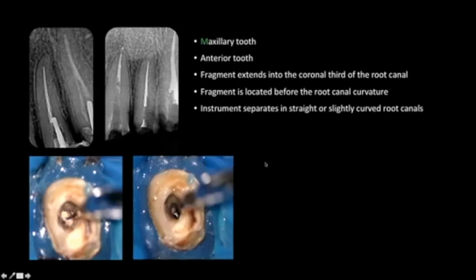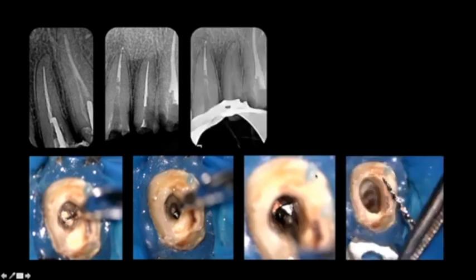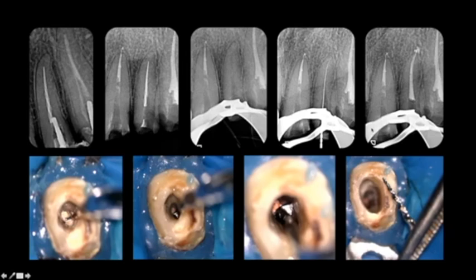Here, we only used ultrasonic. We can catch the instrument easily and retrieve it. This is the file retrieved and the final obturation.